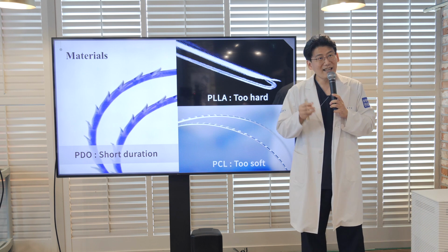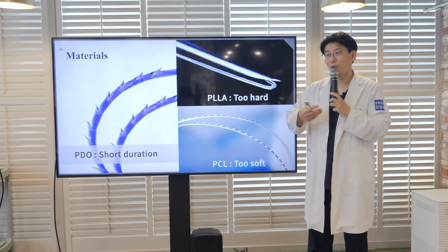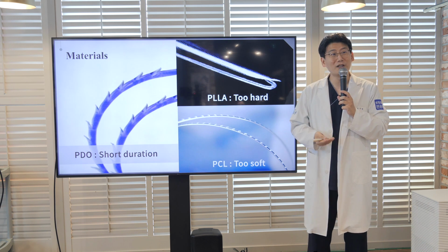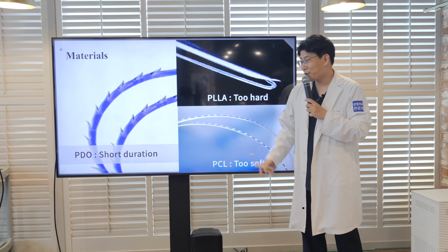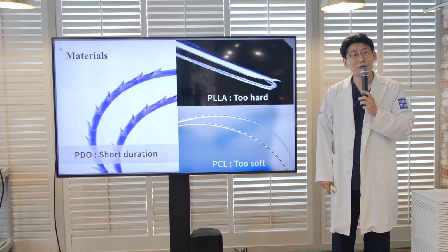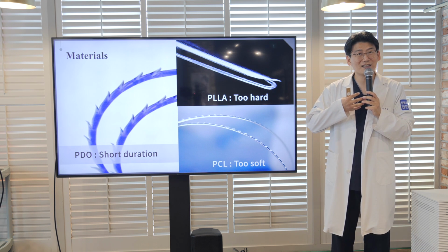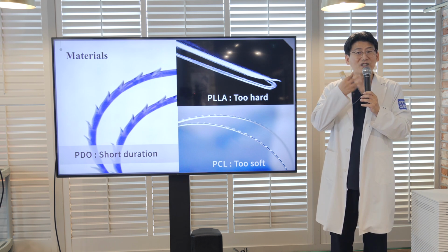But as I mentioned before, the patients want more. The duration of PDO is about 6 months. It's relatively short. So they want some materials which go further.